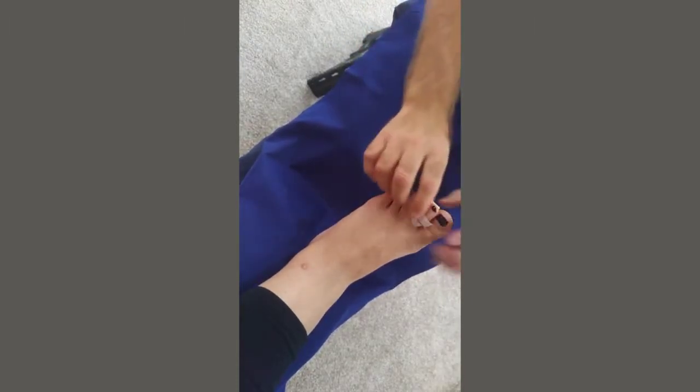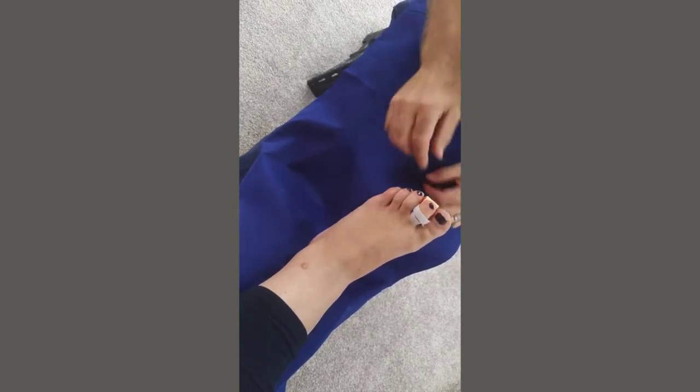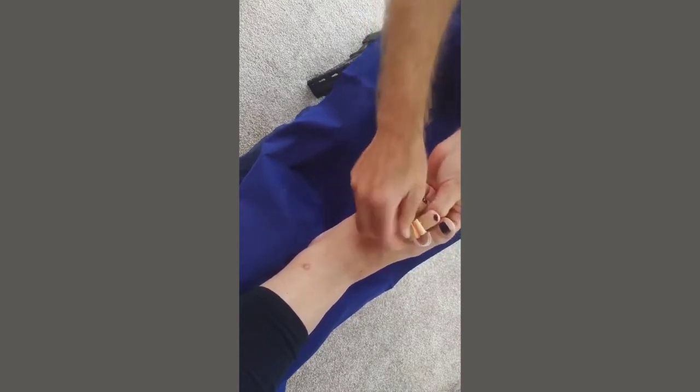Cut off any excess, and that will hold the end of the toe off the ground so it's not taking as much pressure. Equally, as mentioned, you can use it the other way up to protect the tops of toes as well.